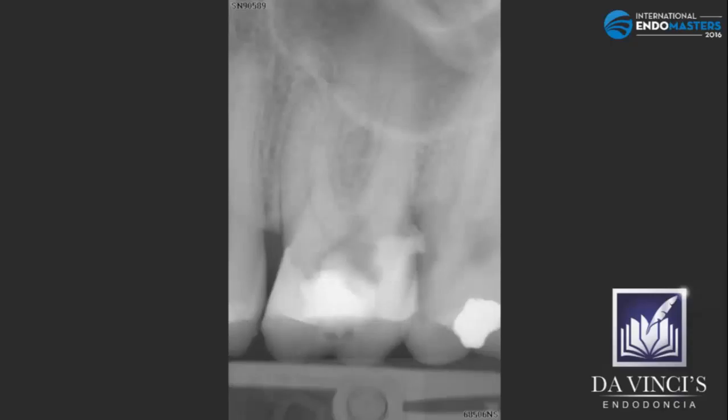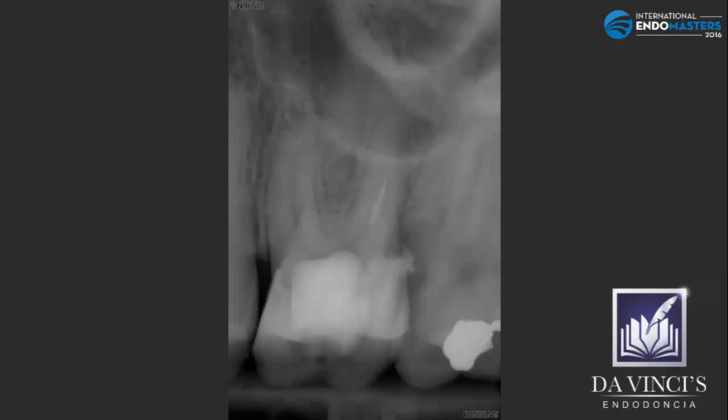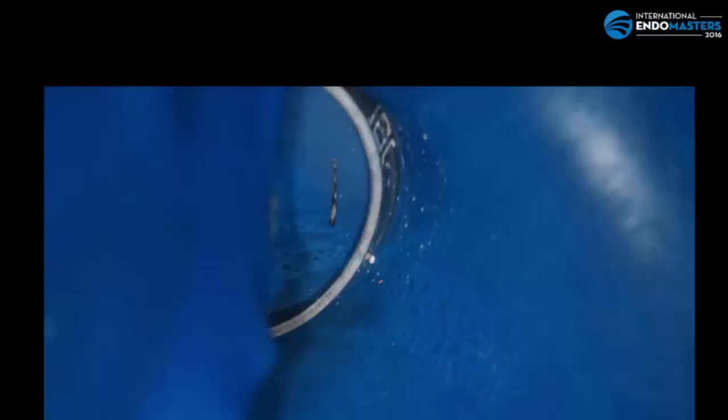We are going to share with you this case. For example, I was using on the distal canal the ProTaper SX, and it broke in the distal canal. Then I bypassed it with the hand file, and I retook the canal with the ProTaper S1, and it broke again. So at this moment I had a problem. I had two separated instruments in the same canal, and I had to remove them. So I removed the first one.